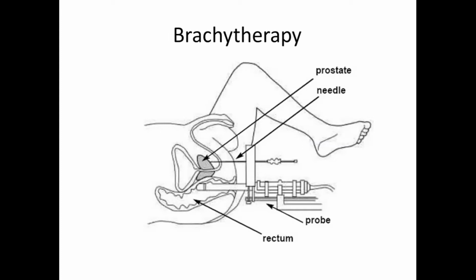So there's a bit of preparation the day before the procedure is done, and that's basically to clear the bowel out as much as possible, because the planning of the procedure is done with an ultrasound probe up the back passage, pointing at the prostate gland. So we need the bowel to be completely empty. So you have a day off your food, just fluids, and a whole bunch of bowel medication to clear people out completely.